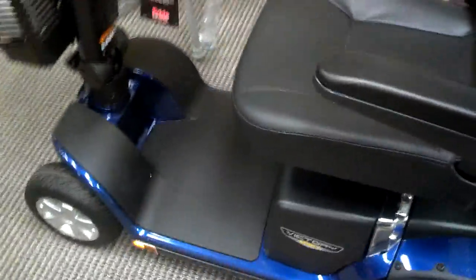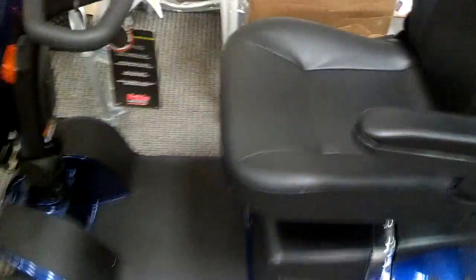Hello, today I'm going to show you the new Pride Mobility Victory Sport. This is a four-wheel version, and we just put it together.